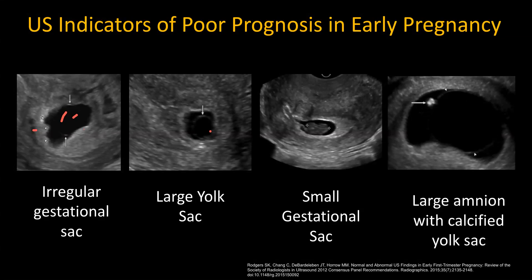A large yolk sac is another sign. If you look at this yolk sac compared to the gestational sac, it's fairly large. The yolk sac in early pregnancy is normally less than 5 millimeters. If you see a yolk sac which is more than 7 to 8 millimeters, that is a sign of poor prognosis.